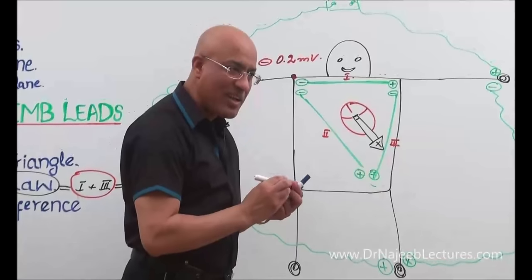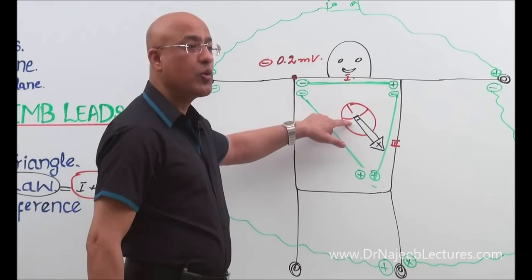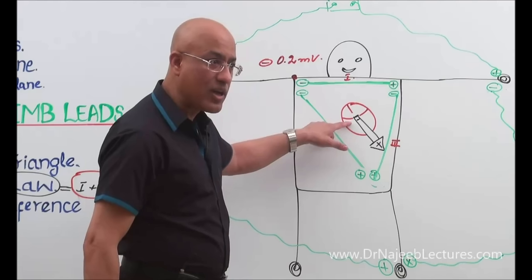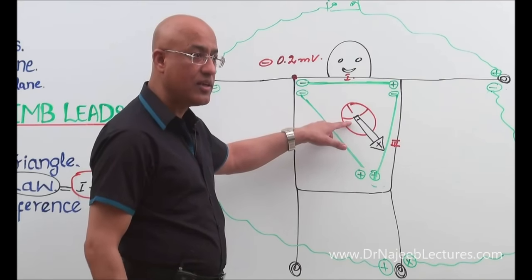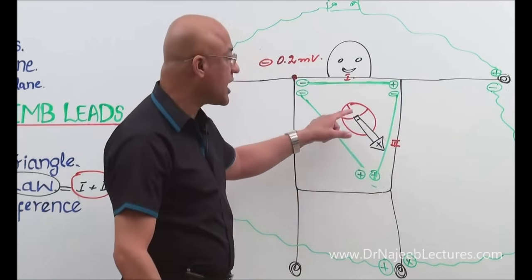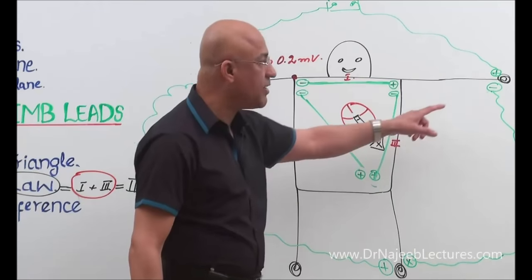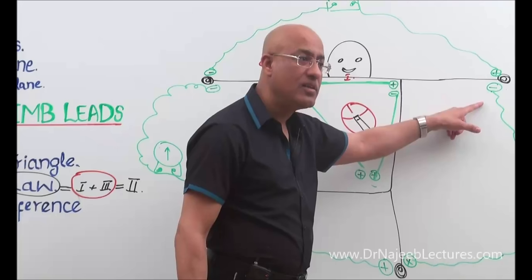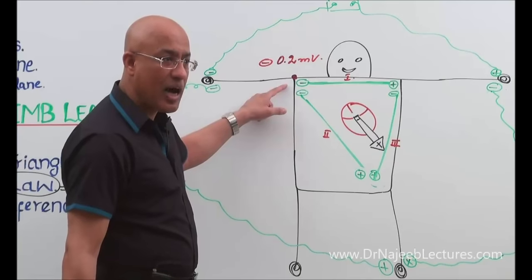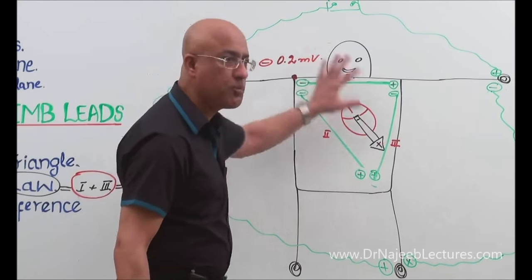I will repeat it: when major ventricular depolarization is going on, the electrical vector of ventricular depolarization is moving down and left in the frontal plane. So positive charges are moving down and left. So downside and left side become positive potential, and of course right and up should become negative, as compared to the average body potential.